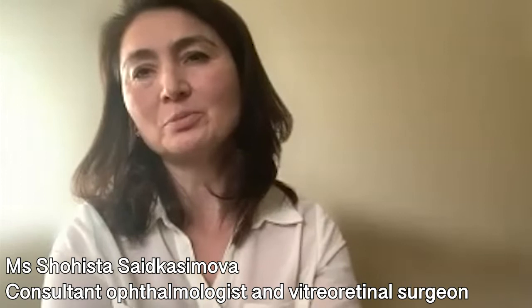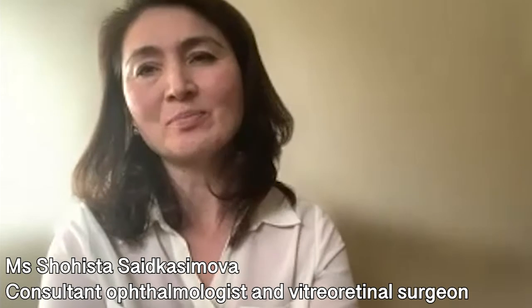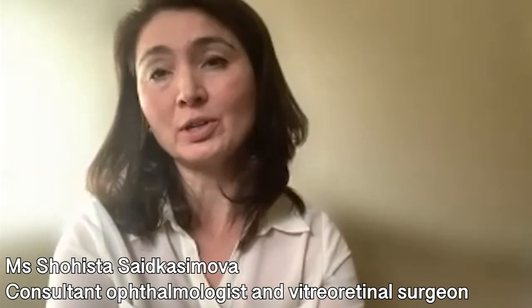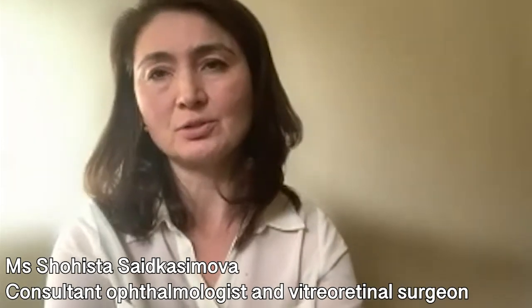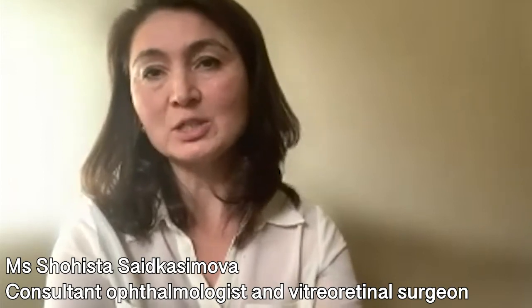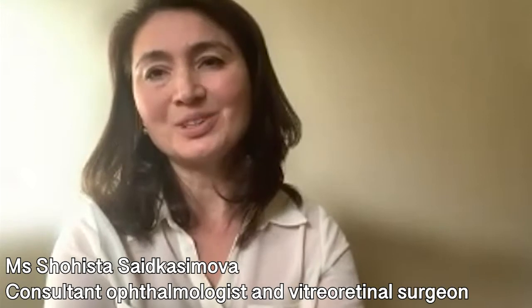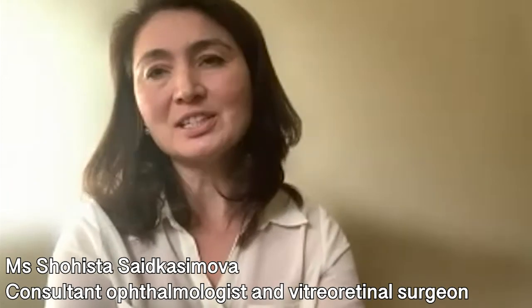So during this process, it is possible to injure the bag where the lens sits. And if that happens, we call it posterior capsule rupture. That's one of the most common complications, and the incidence is quoted as 1 in 100. In a more complex case, the incidence may increase to 2 to 3%. And if that happens, then the lens will be required to be removed from the back of the eye. So we will need to convert the procedure and add the step that we call vitrectomy, where the lens will be removed with the gel that fills the cavity of the eyeball. So that's the most common one.